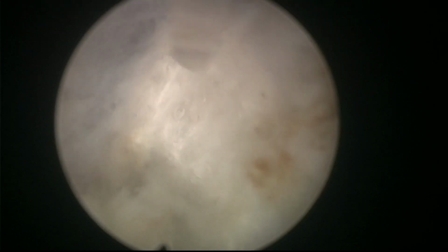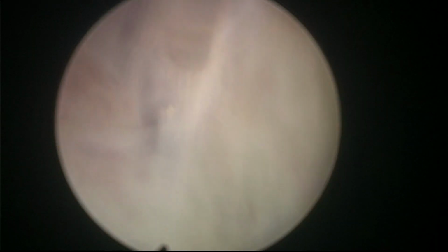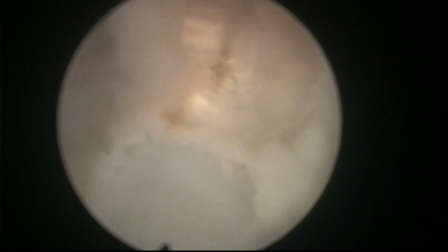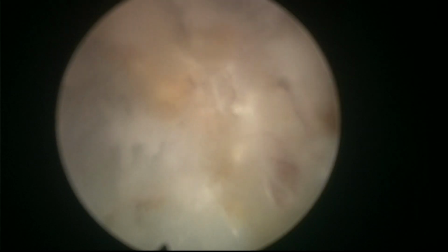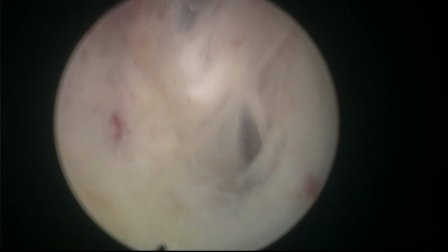So we are constantly trying to challenge the plane that we have and to see if the plane is correct. Here, as I said, you see, sometimes if you are a little bit stubborn to try to construct a nice line of attack, line of dissection, it looks a little bit yellowish, you see, and I like to remove the yellow tissue. Who knows what that would be also histologically, no?